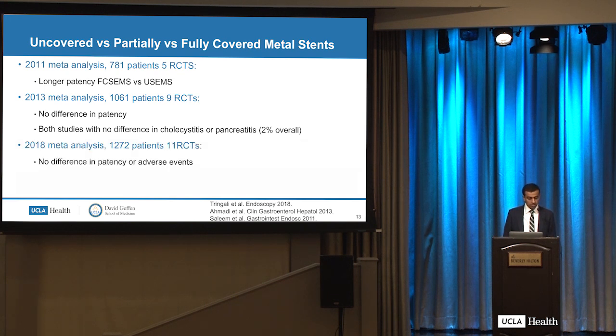The more recent meta-analysis, with slightly different methodology, also found no difference in overall patency or adverse events of uncovered versus covered stents. And why?